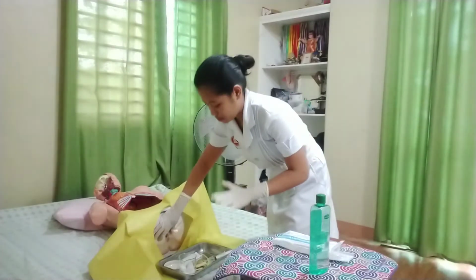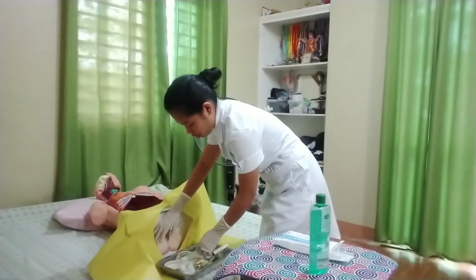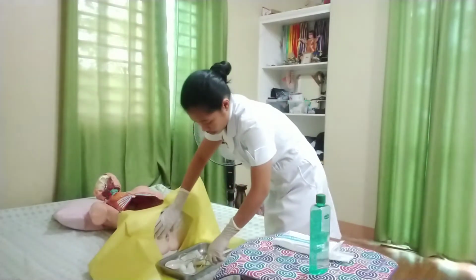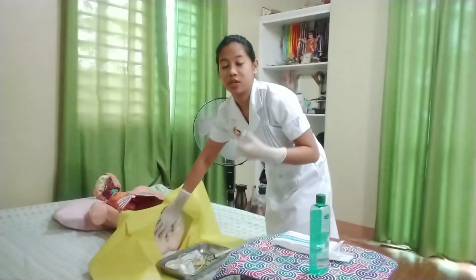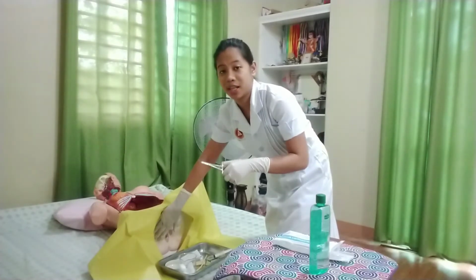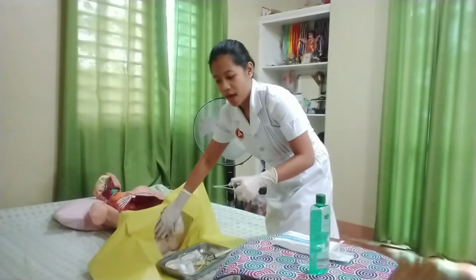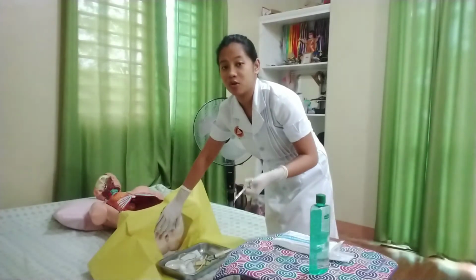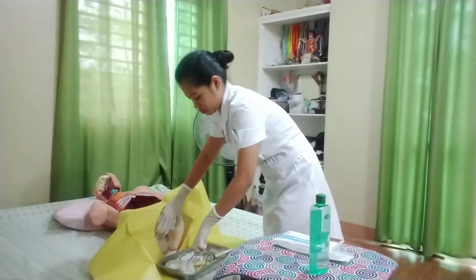So now that it is spread, using cotton balls held with a forceps, I will clean both labial folds and directly into the meatus. For the meatus, we will start cleaning above the meatus downwards to the rectum. And we will discard every cotton ball we use after every one downward stroke.